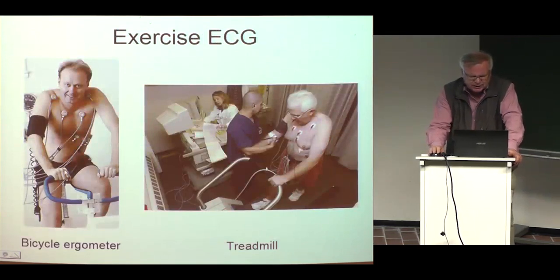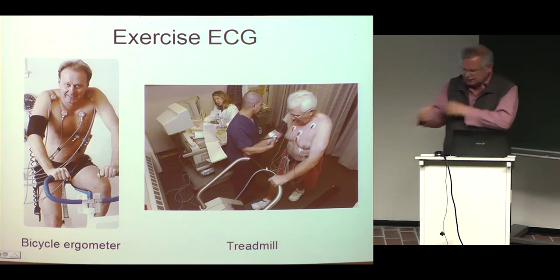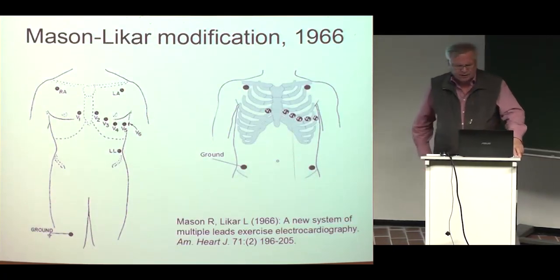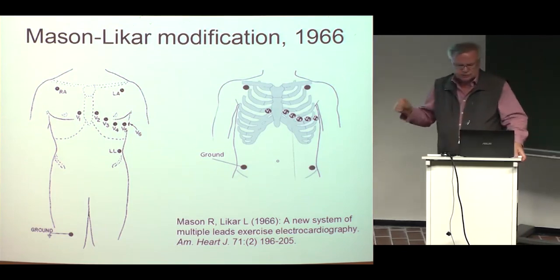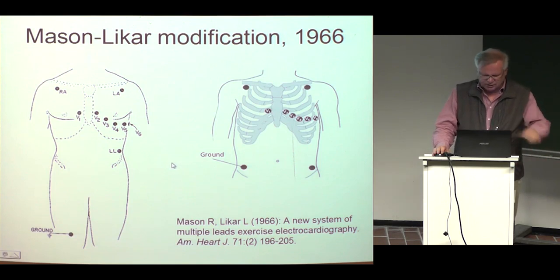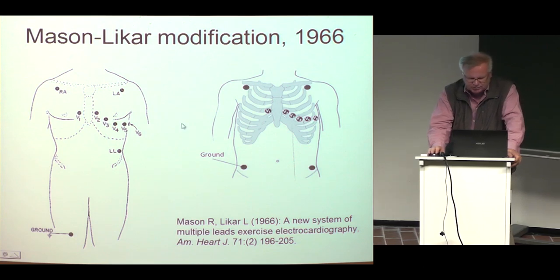The problem in this exercise ECG recording is that because of the muscular movement and the electromyogram coming from the muscles of the arms and legs, a lot of noise comes into the ECG signal. And Mason and Likar developed the Mason-Likar modification, which is the standard modification used in exercise tests. The idea is to avoid the arm and leg movement noise by placing the arm electrodes here, right arm electrode, left arm electrode, and left leg electrode here. That is the difference. The chest precordial electrode points are the same as in the normal 12-lead ECG.